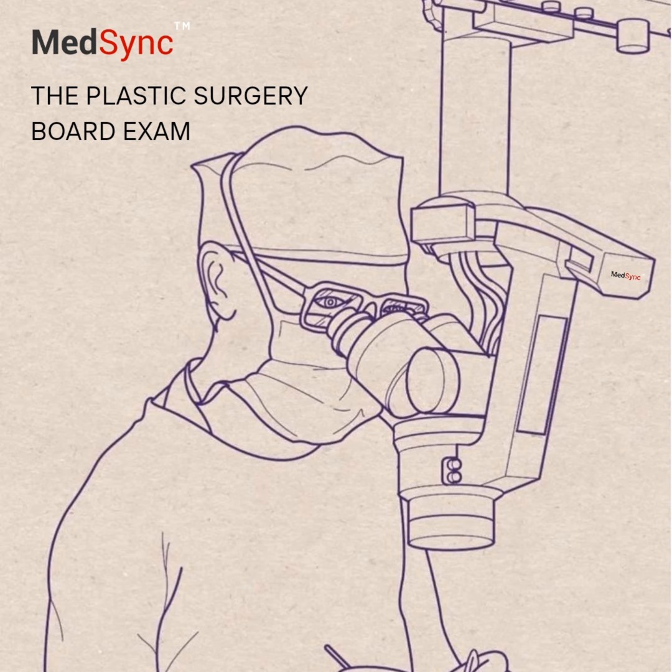Lasers used. Again, a variety. KTP 532, Ruby 694, Q-switched and long-pulsed. Alexandrite 755, Q-switched and long-pulsed. Diode 800, Nd:YAG 1064, especially Q-switched. Even ablative lasers like Er:YAG and CO2, fractional lasers, and IPL. What sort of lesions are treated?